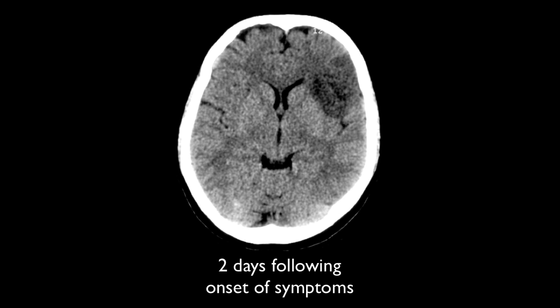Let's start off by looking at a case. This patient presented two days following onset of right-sided weakness with a well-demarcated low-density region in the superior division of the left middle cerebral artery territory. Note that the caudate head and lentiform nucleus are spared, suggesting that the most likely embolus lodged in an M2 branch, sparing the M1 branch from which the lenticular striate perforators originate.